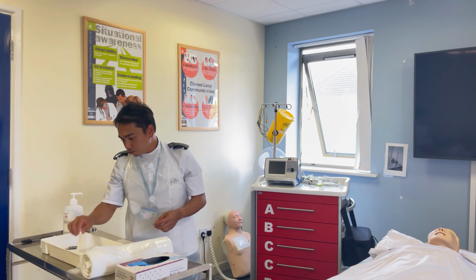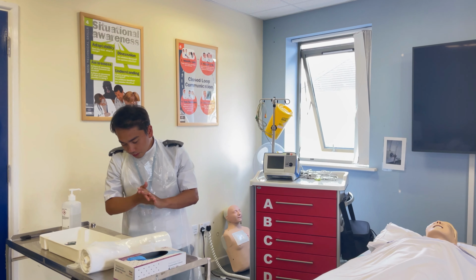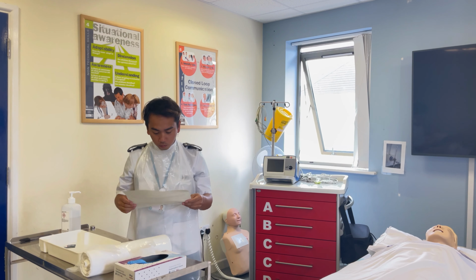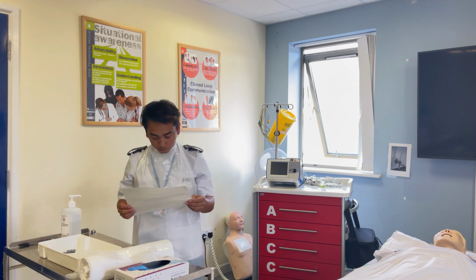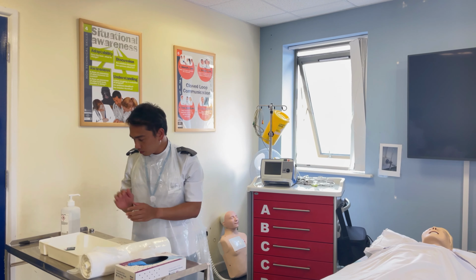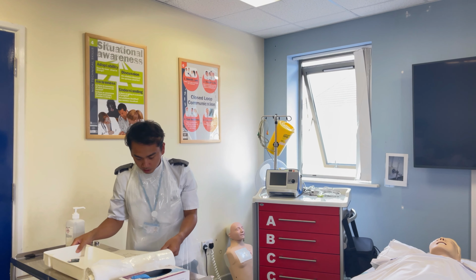Since I already have the materials I will be needing, I'm happy to go to my patient. I already checked the drug as well, since it's an IV flush. I already checked it with another nurse to confirm it's the right medication or right flush. So I'm now happy to go back to my patient.